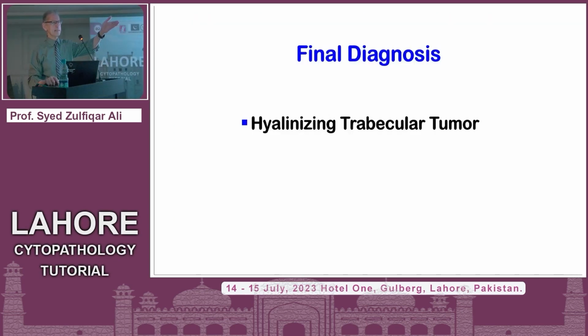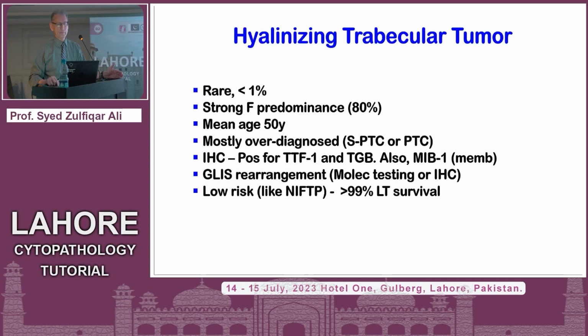And you just asked me the question about hyalinizing trabecular tumor. This is a hyalinizing trabecular tumor because this is a tumor which has many intranuclear inclusions that you typically would not see in medullary or papillary carcinomas. So we know it's very rare. I'm not going to go into detail, but the latest thing does show the GLIS rearrangement. It's a very low risk tumor like NIFTP.